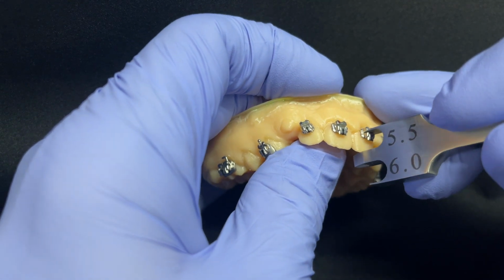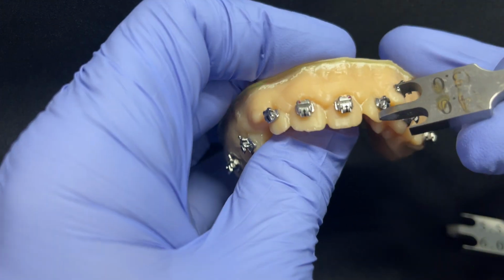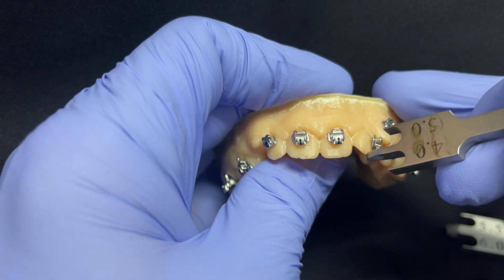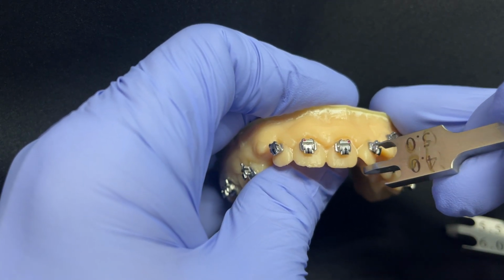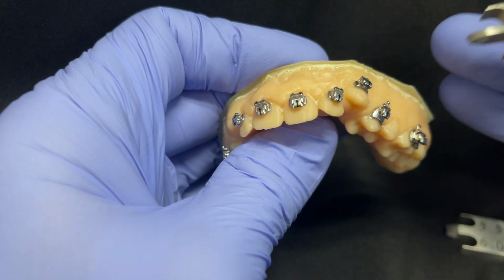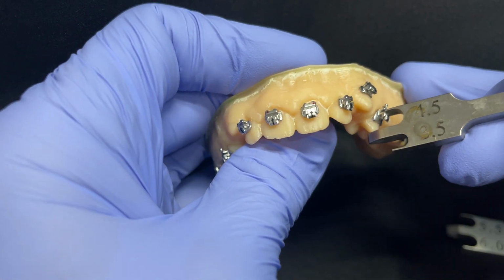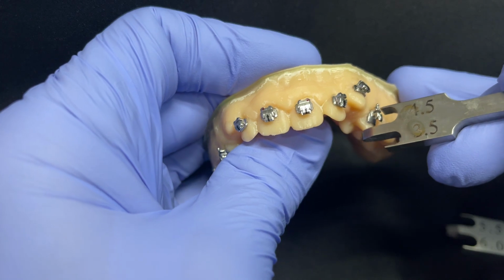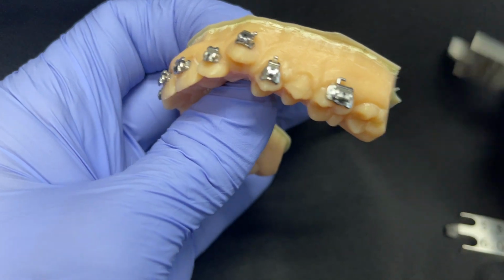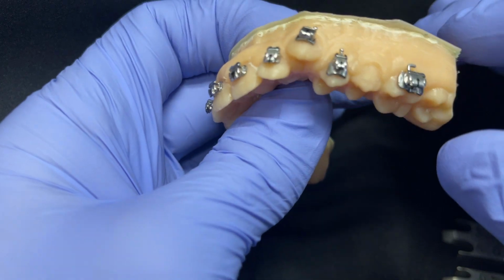So the centrals are going at 5.5, laterals are going at 5. Okay, and then, oops, we'll get that on there. And then cuspids are 5, and first bicuspids are going to be at 4.5. So let's check that out, 4.5. And bring the guy down just a little bit. All right, cool. So that's all we got to do. It's just simply adjust. The posterior teeth are like your base arch, if you will. They are the component that's going to be very challenging to move.